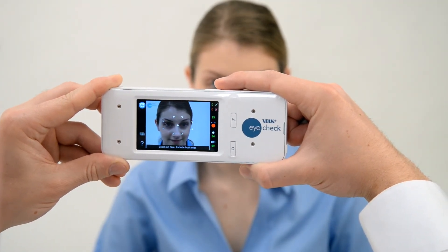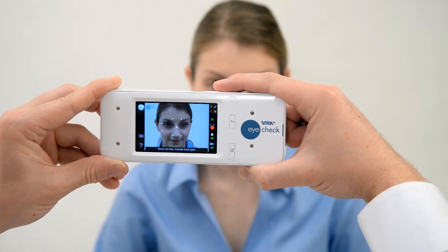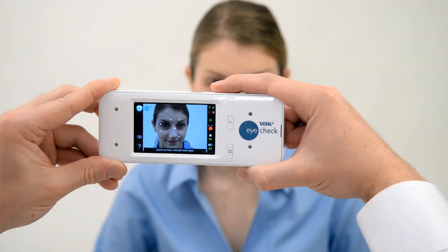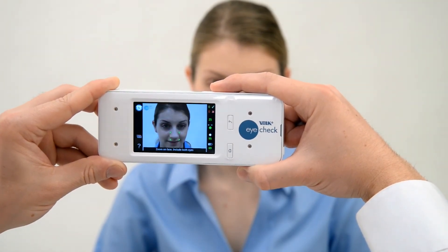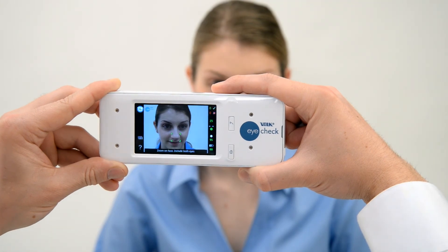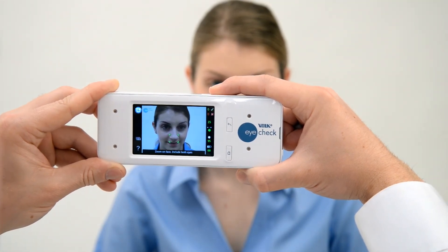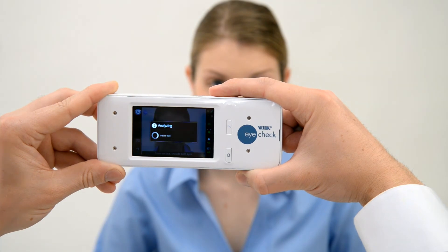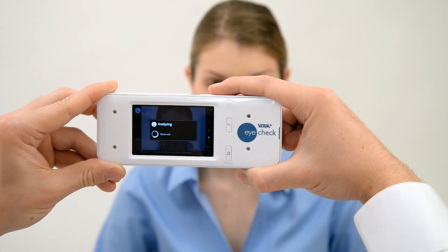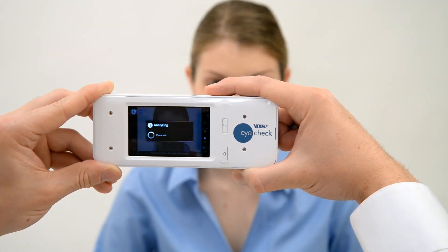Half-press the shutter button to achieve correct focus. Correct focus is indicated by the white focus squares changing to green. If the focus squares turn to red, make any necessary adjustment, then half-press the shutter button again. Fully press the shutter button to take the photo.